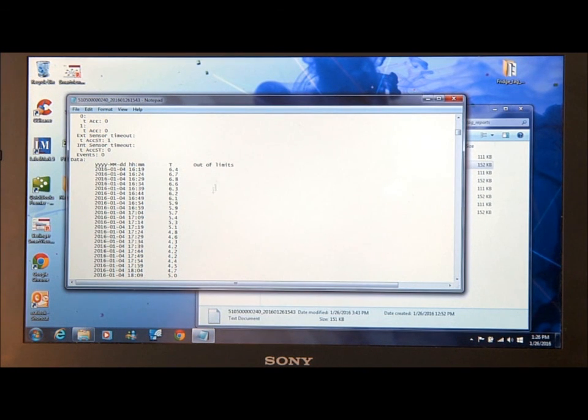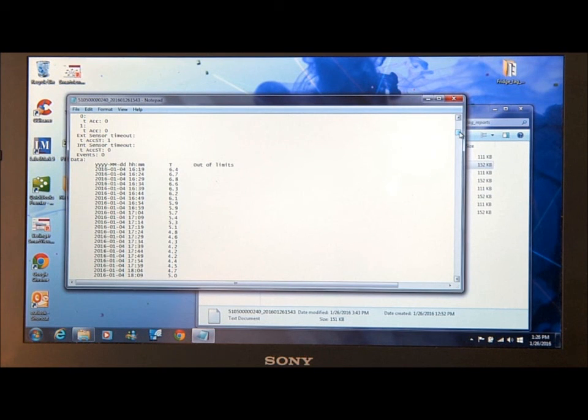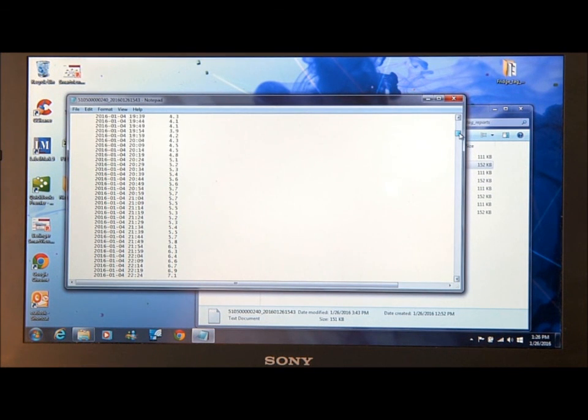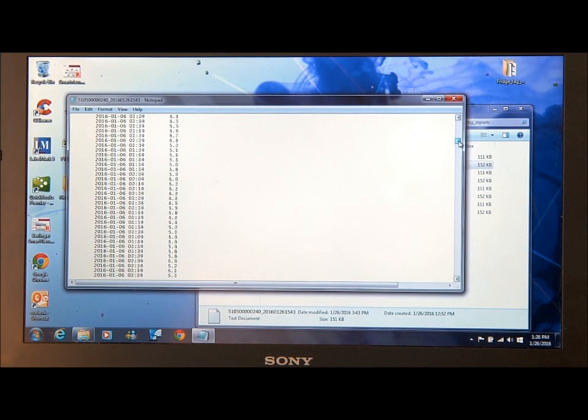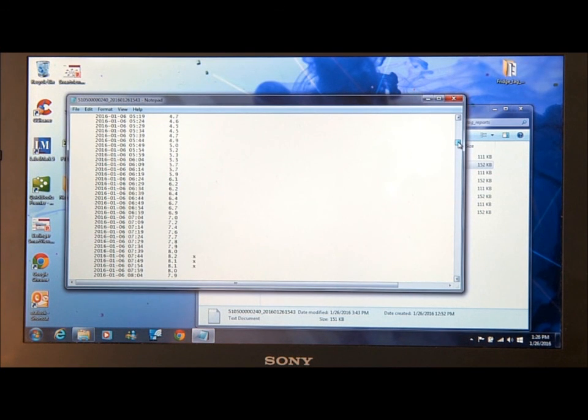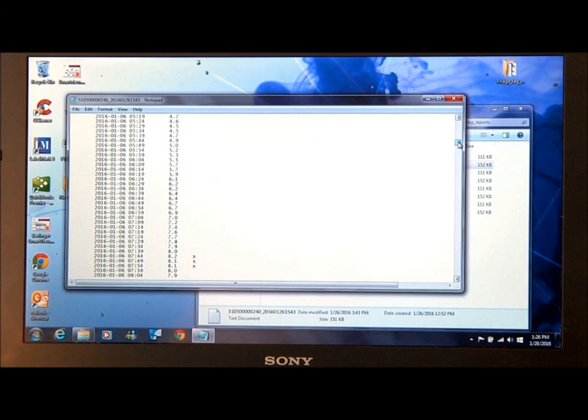There's also an out of limits column, which if you're looking for some alarm data, you go to the right and scroll down, and when you see an X as you see here.